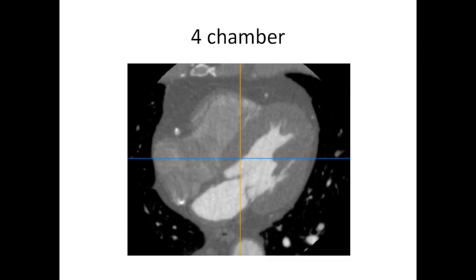First, we're going to talk about the four-chamber view. This view sees all four chambers of the heart. On CT, in many cases the basic axial view allows you to see all four chambers — right atrium, right ventricle, left atrium, and left ventricle. However, for it to be a proper four-chamber view, you do need to adjust it slightly so that you can see the full extent of all four chambers. That's the first view, the four-chamber view.